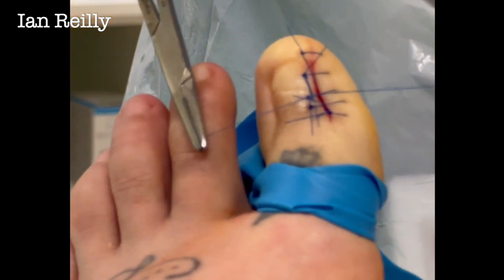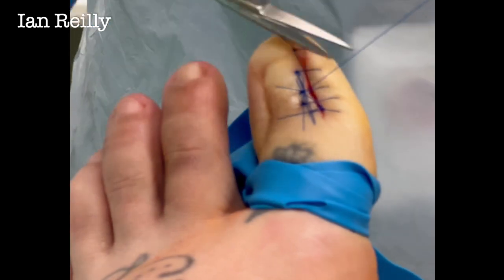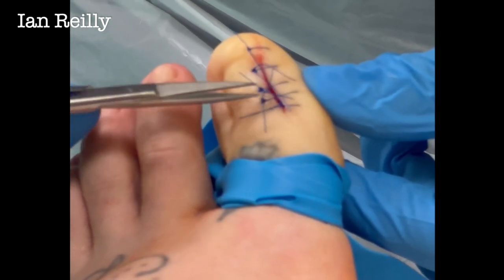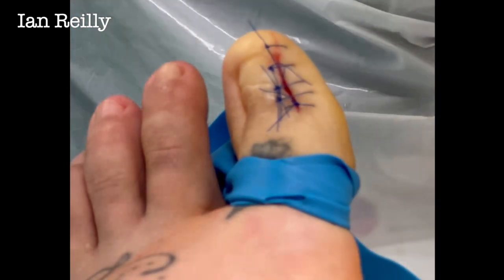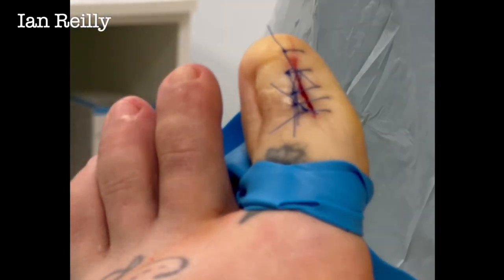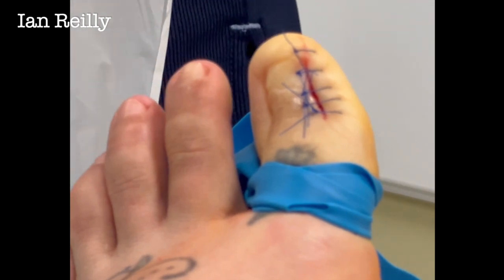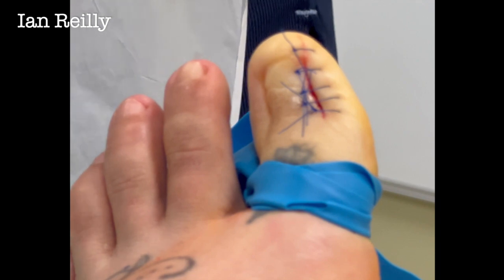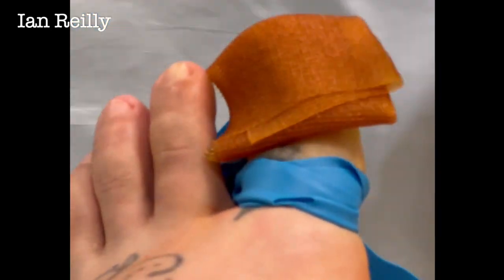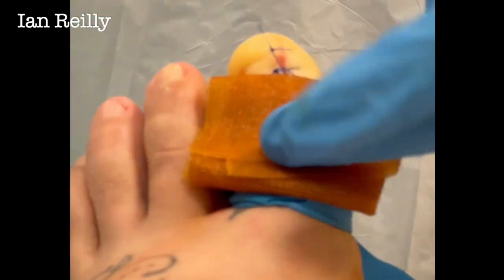We're about 90% closed there, and the last little bit will heal by secondary intention. That's nice and tight. Just as a suture pedant, we want to get those little tags out — a little bit of OCD — and bring all those knots just across to one side. Maybe give them a little shave. That's our nice neat wound. I'm going to put a little bit of antiseptic on — iodine — no allergies — as much as anything it's really for the non-stick factor so it doesn't stick to the wound. We leave the stitches in normally about a week to ten days.